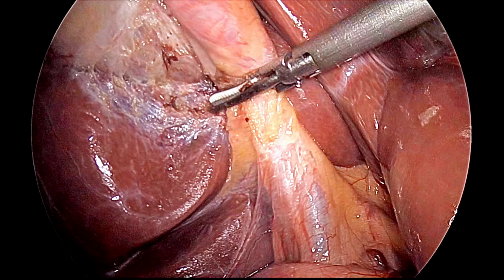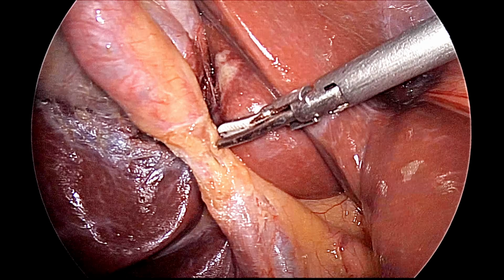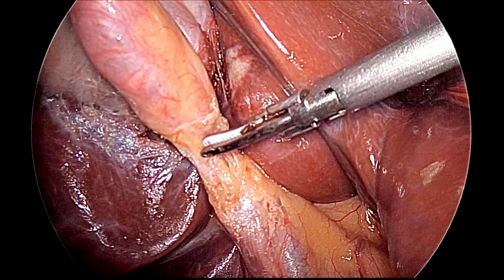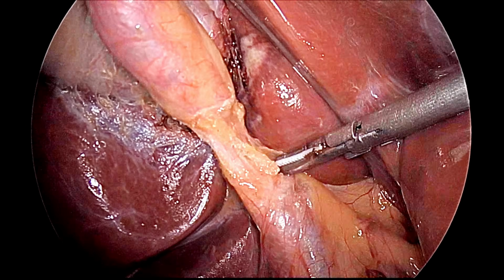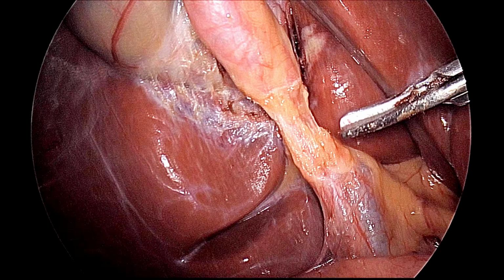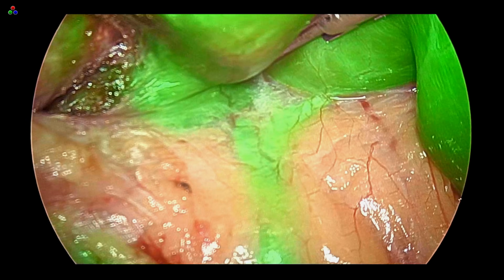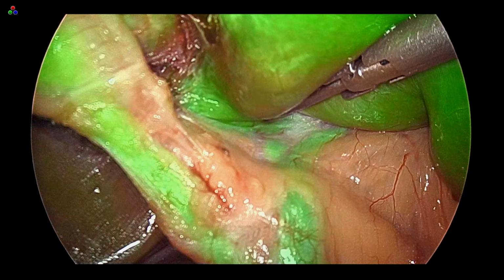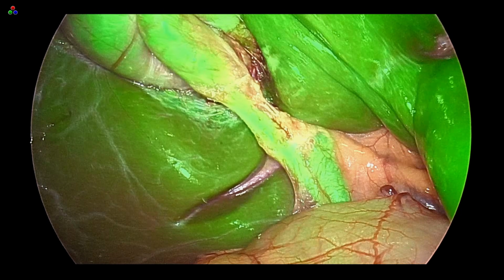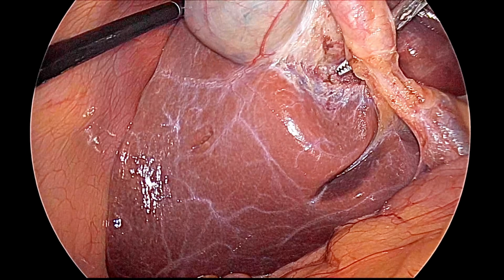And now after that, we have already injected 1 ml ICG just 45 minutes before the surgery. So, you can turn the ICG mode on, and you can see the anatomy. So, we can see this is the CBD, and the ICG mode is on. This is the common hepatic duct, this is the right and left hepatic duct, and this is the cystic duct, which is clearly visible.